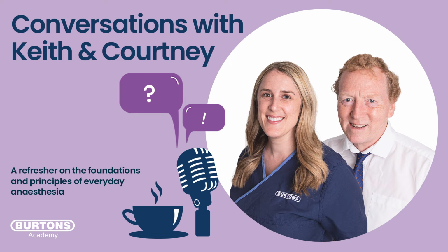And it breathes in so quickly that it pulls some of that CO2 back in from the expiratory limb along with the fresh gas. And therefore, as it breathes in on that phase 0, we're going to see the phase 0 drop, and then it's going to go back up again as it sees that CO2. And this is the point I was making earlier on. That CO2 going back up isn't a second expiratory breath. That's an actual inspiration, but it's going up because we're actually rebreathing CO2. So we get a little blip, a little sort of double kink.